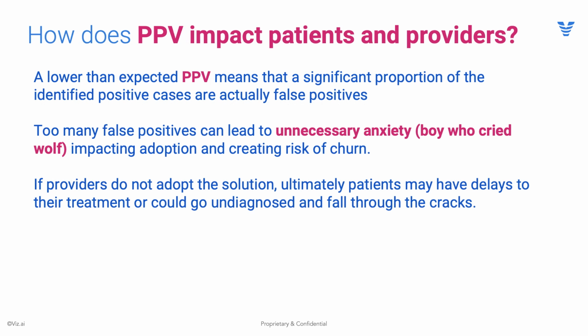So again, what does it mean for providers? While there are different levels of tolerance for false positives, which I just mentioned, based on the acuity and rarity of disease, the bottom line is it's a trade-off. Are they willing to accept the false positives to be able to view those true positives? We're taking a needle in a haystack without an AI algorithm, and we're making it into maybe an iPhone in a haystack. Still maybe hard to find, but it's in there somewhere and a lot easier to find than it would have been had it been a needle.